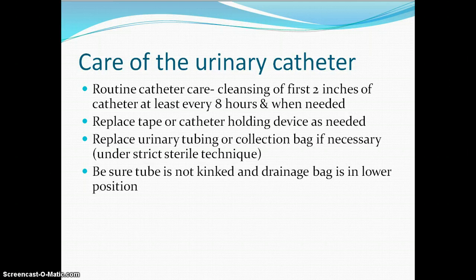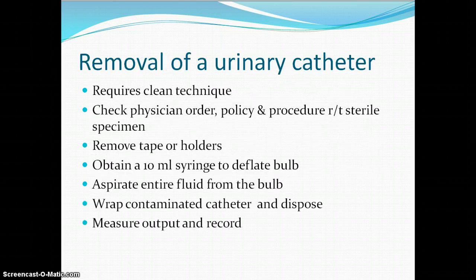We never want to go from the catheter in because that would be introducing bacteria to that area. If we get a hole in the bag, we would need to change the bag. I've had that happen before when it got caught in the wheel of the wheelchair and put a hole in the bag, or if something else happens to that bag that would cause it to be damaged.